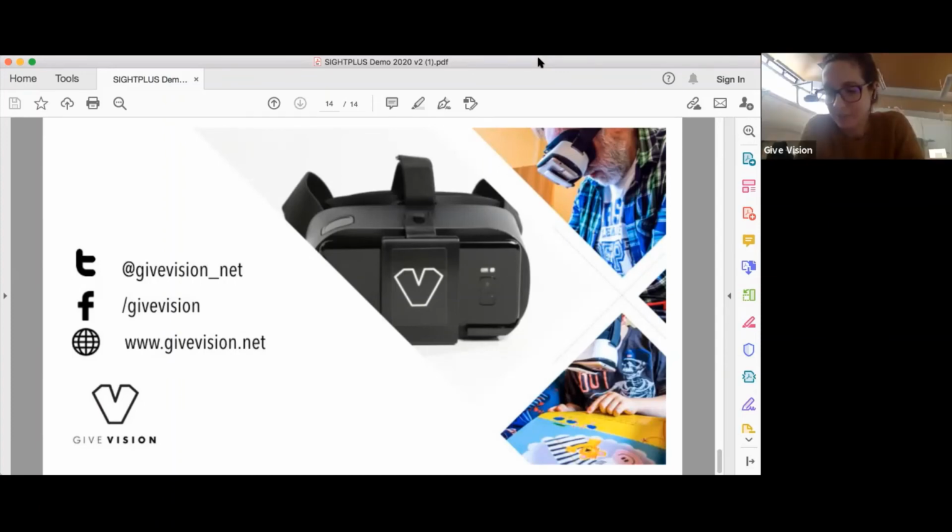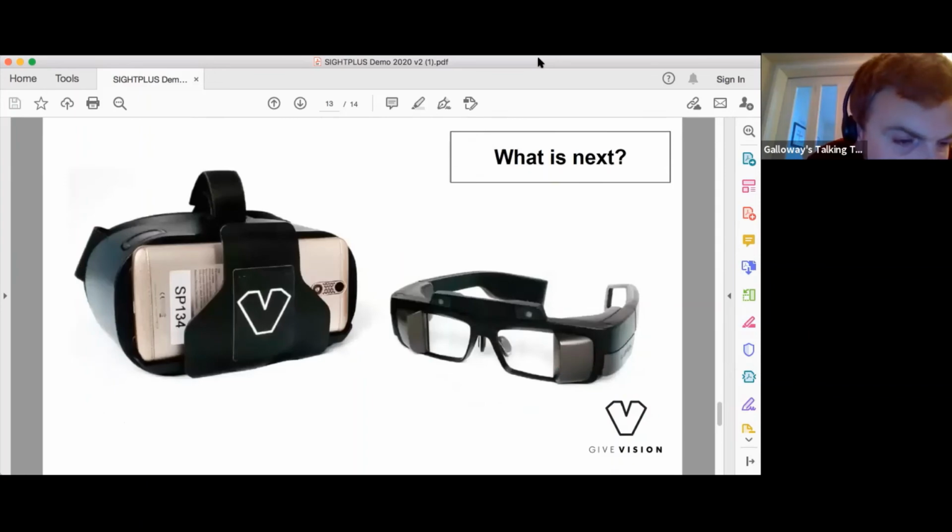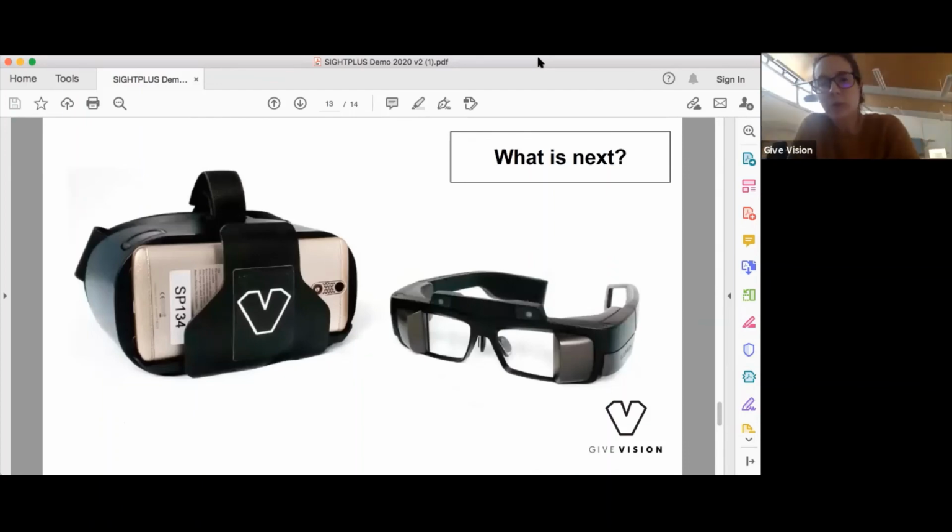Yes, there's a picture there of the headset, and then at the right hand side a picture of a traditional kind of smart glasses. When we talk about miniaturizing the hardware we're working on, then we're talking about smart glasses. We've tried many of them, and maybe some of you have tried some too, because we're not the only ones to do this, and we've seen so many more head-mounted devices now transformed as low vision aids. But the main limitation is the field of vision.